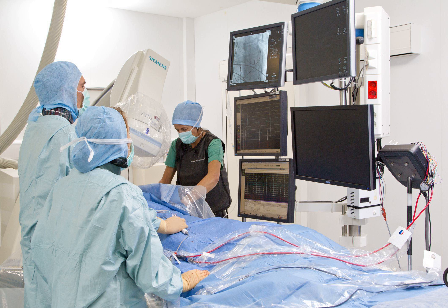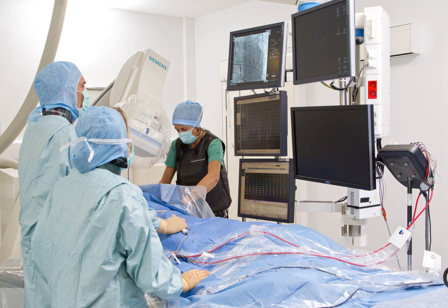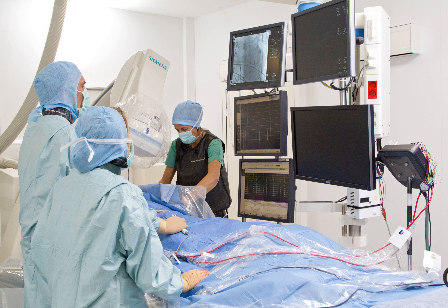Step 5: A tool called a hysteroscope will be inserted through the opening and into the uterus. Step 6: Your medical professional will feed the catheter and ablation tools through the hysteroscope.